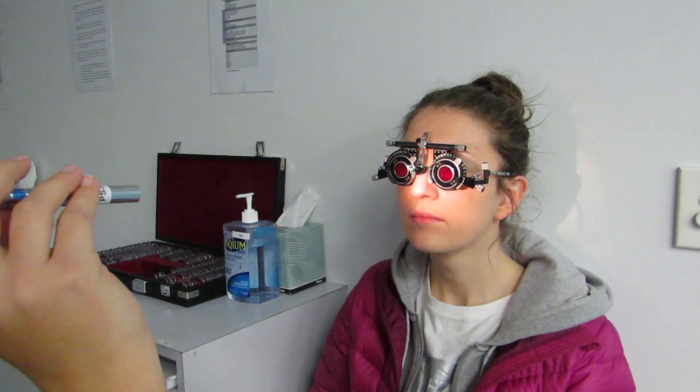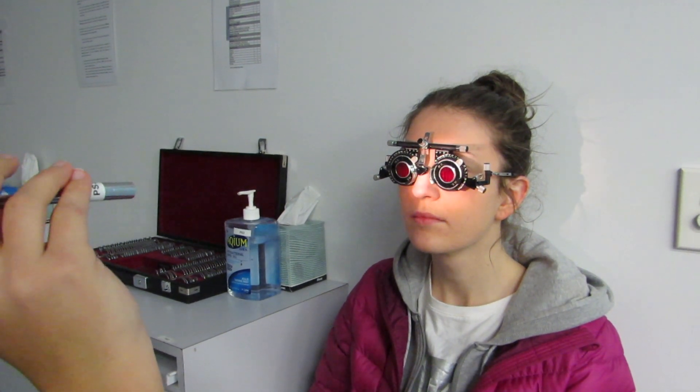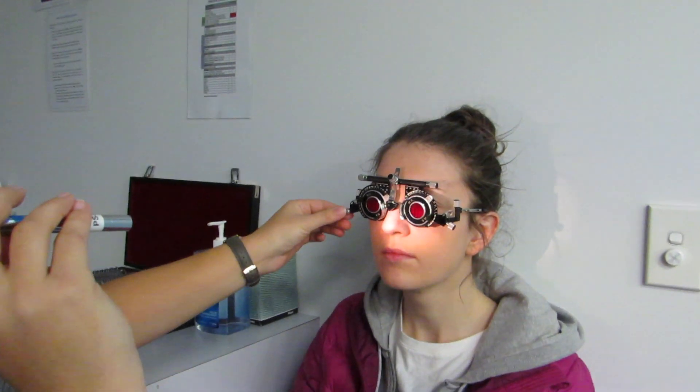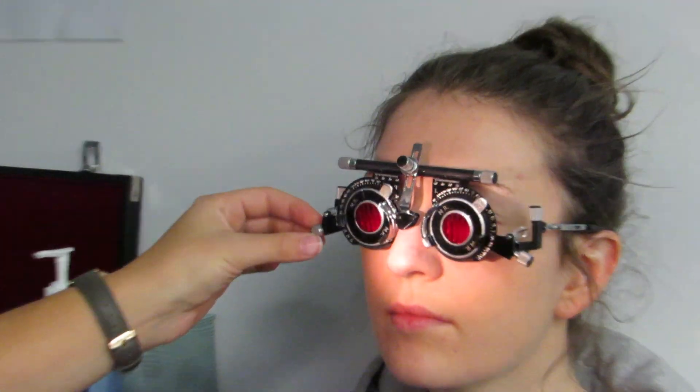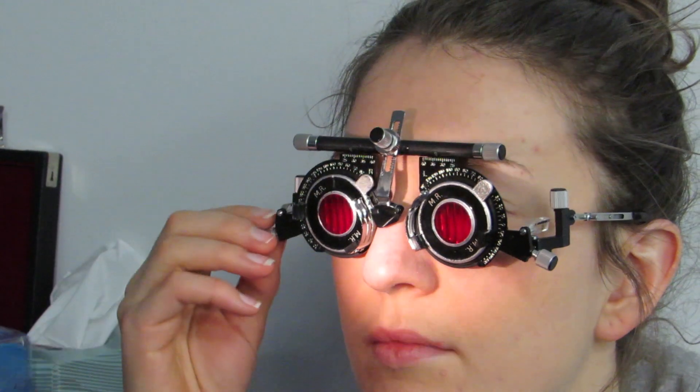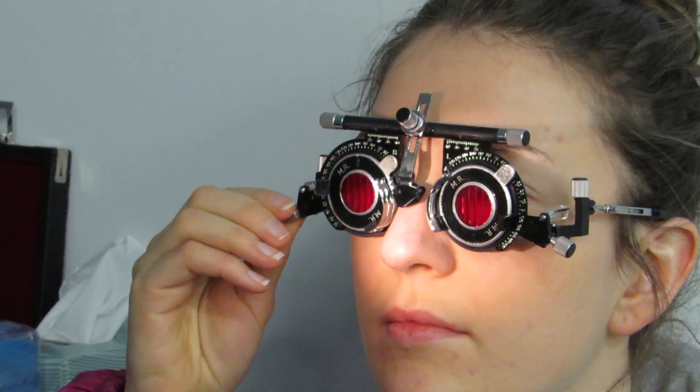The clinician instructs the patient: 'What we're going to try to do is make those lines nice and parallel, if possible. There's a little dial on the side that we can rotate to make the lines parallel.' The patient is guided to turn the dial until the lines appear parallel.